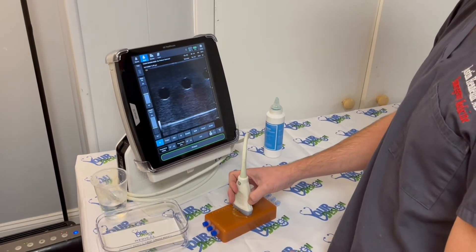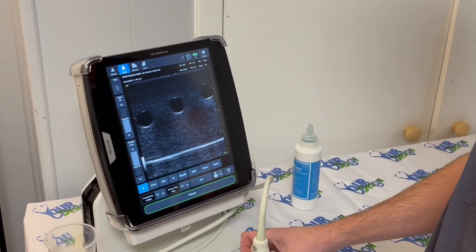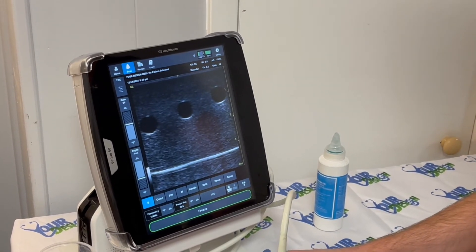Every machine will be different. If you need help, reach out by email. Set your depth to be just below or at the edge of the phantom to avoid reflections, and get to practicing.